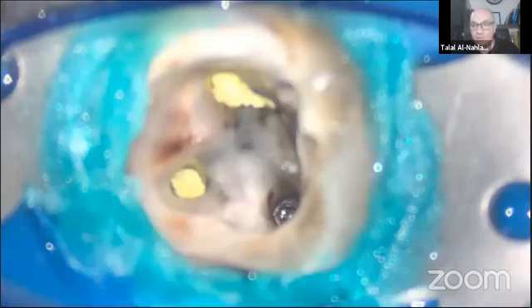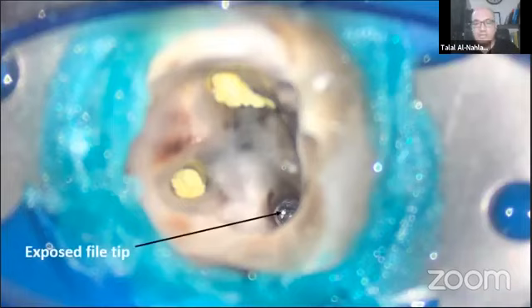I enlarged with GG file size 2, size 3, and I exposed the broken file. My treatment plan was here. First, to use the ultrasonic to expose 1 millimeter of the broken file in order to catch the broken file and to remove it using the loop technique, because the broken file is long. When it's longer than 4 millimeters, I prefer, as recommended by Dr. Tirushi, to go with the loop technique, loop devices.